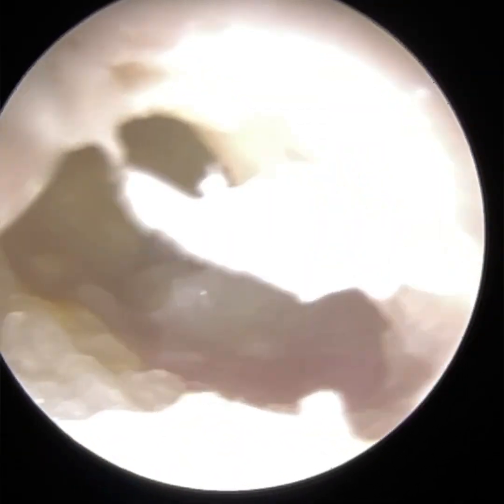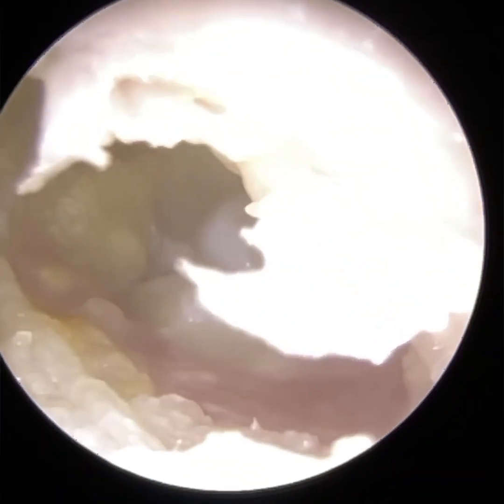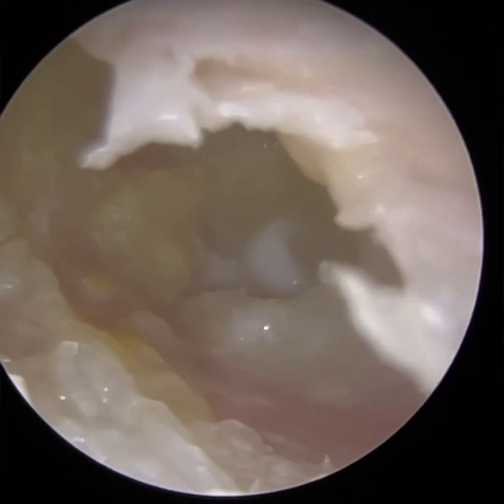And we have a very interesting case for you here. It's of a patient who is suffering from a condition known as acute otitis media, which is a middle ear infection. So the middle ear is the space behind the eardrum.